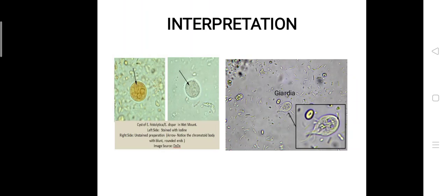So this report should be considered preliminary, while the final report could be available only after the results of the concentration and permanent stain smear are available.